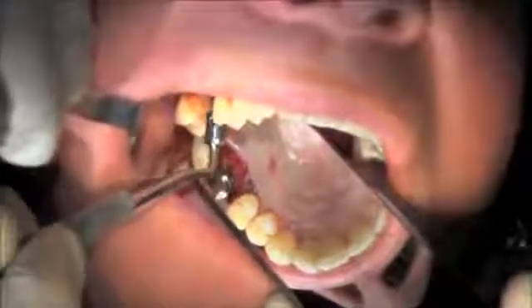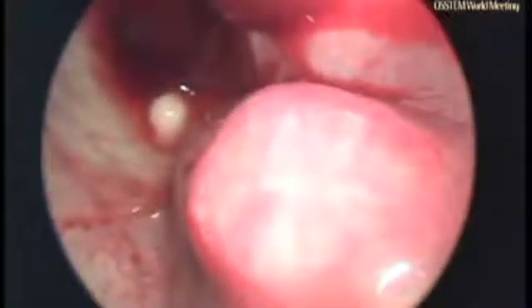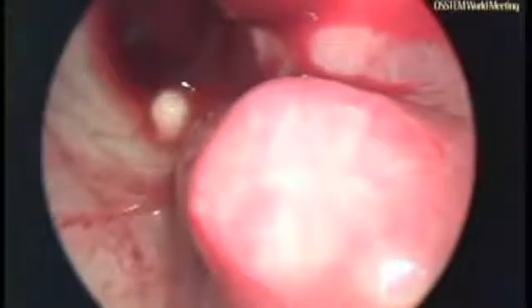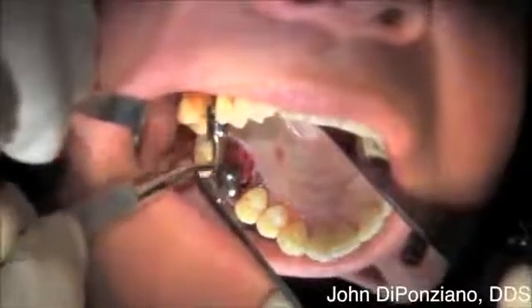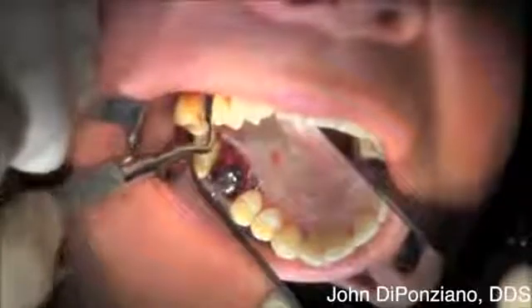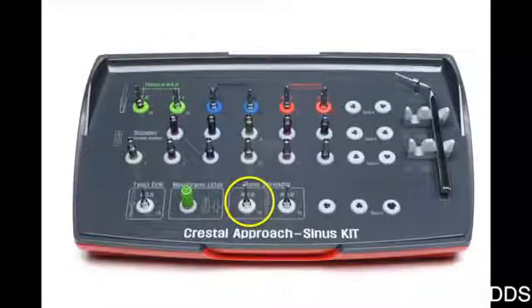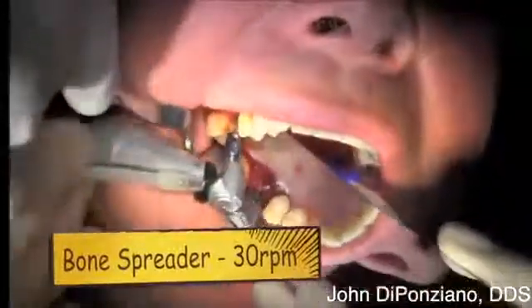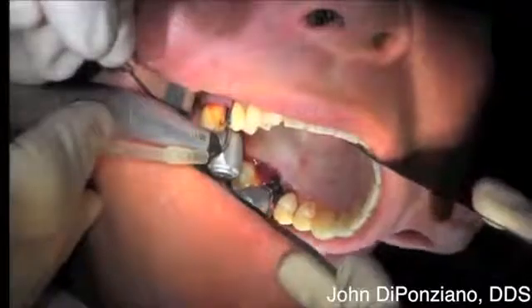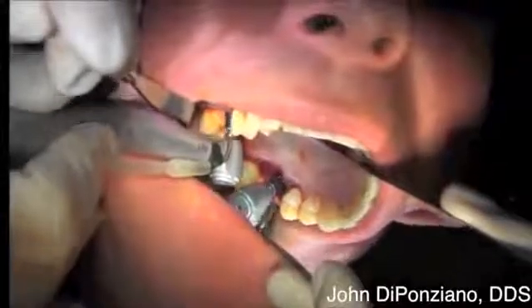Now you'll see the view from the endoscope shown at the symposium, showing what it looks like as the bone is packed in. You can see a good amount of lift as well as width — so it's not just height but also width when this hydraulic system is used to raise the sinus. At this point we use the bone spreader at 30 RPM with that same 9mm stopper, ensuring no instrument goes beyond the amount that was raised with the CAS drill. It just moves the bone around a little bit.